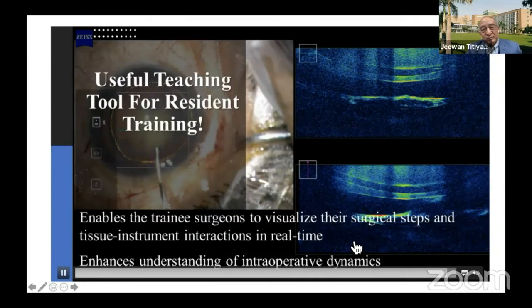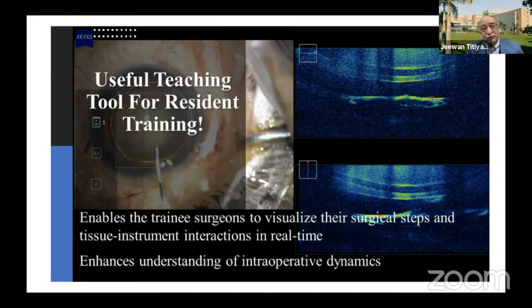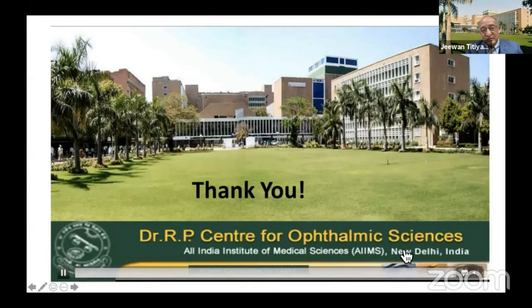It also complements the pre-op anterior segment OCT, which you have done to assess the type of cataract in your cases. So if people have access to IOCT, definitely that's going to help their surgical acumen and the steps which they can do.